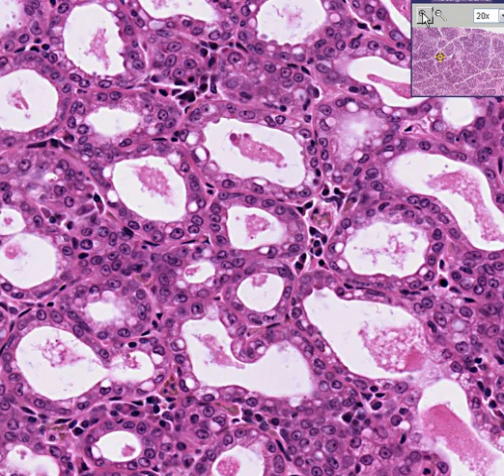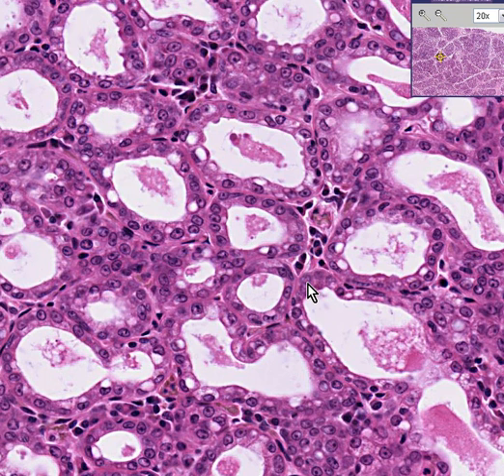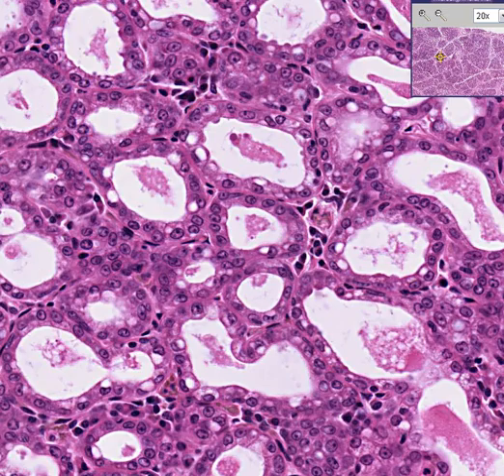I often say that the lactating breast is the only normal tissue I can think of — besides the intermediate lobe of the pituitary — in which the acini are so distended they look like thyroid follicles. This is a normal lactation hyperplasia of pregnancy. Thank you.